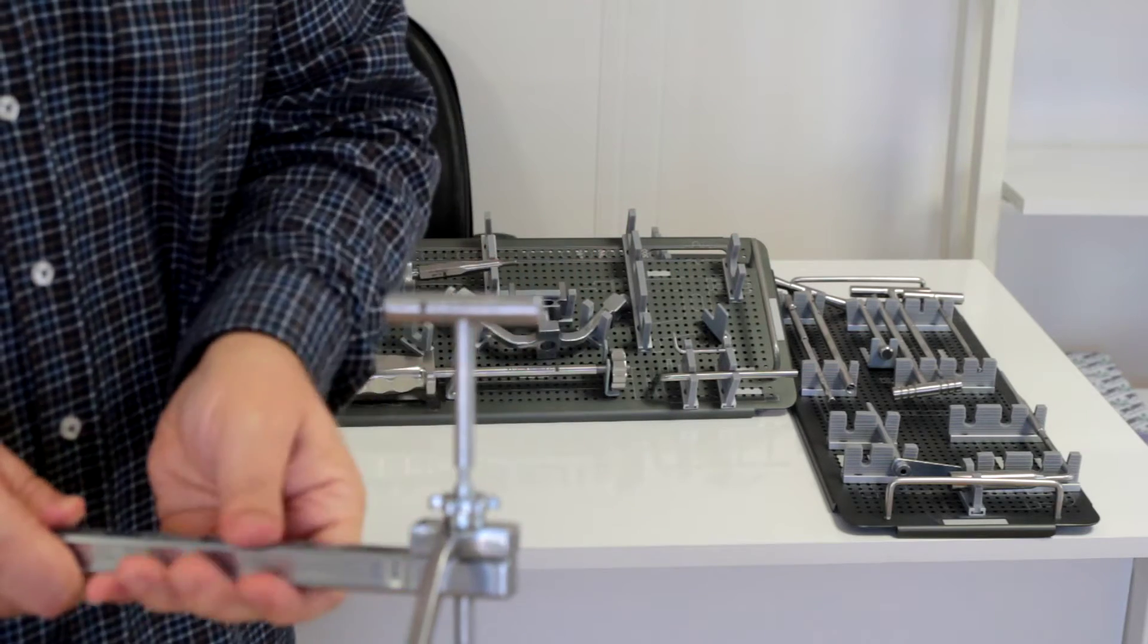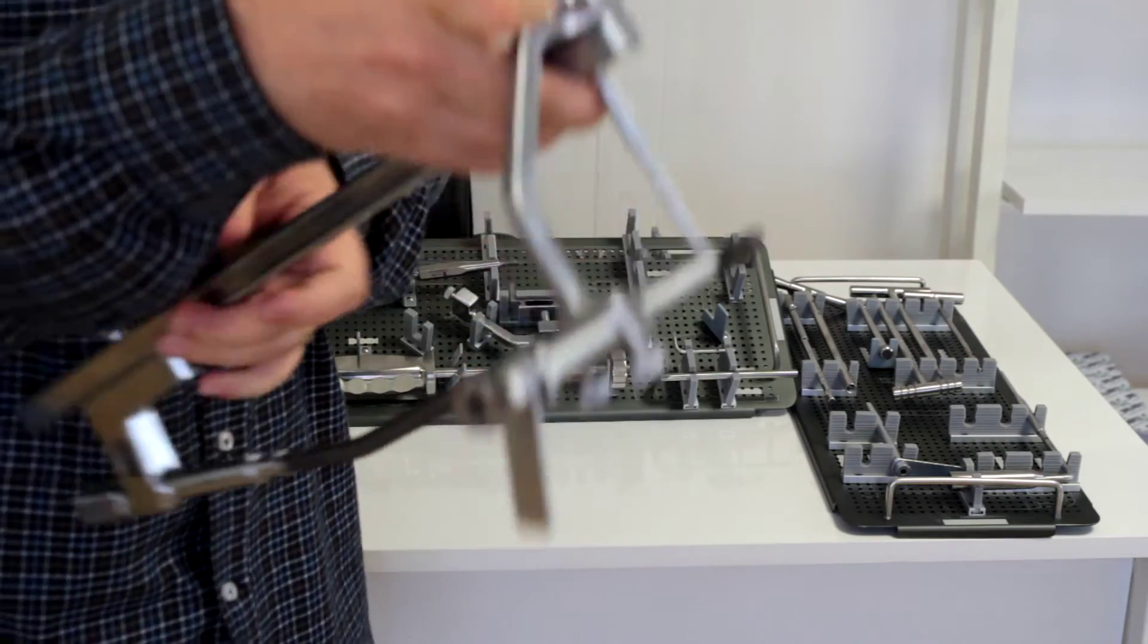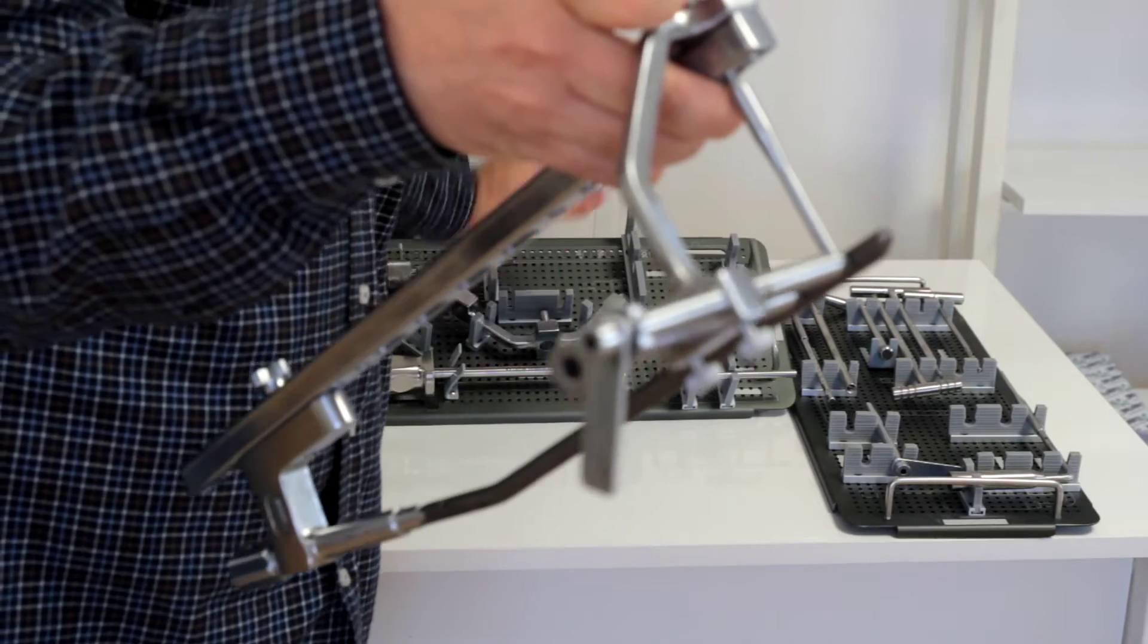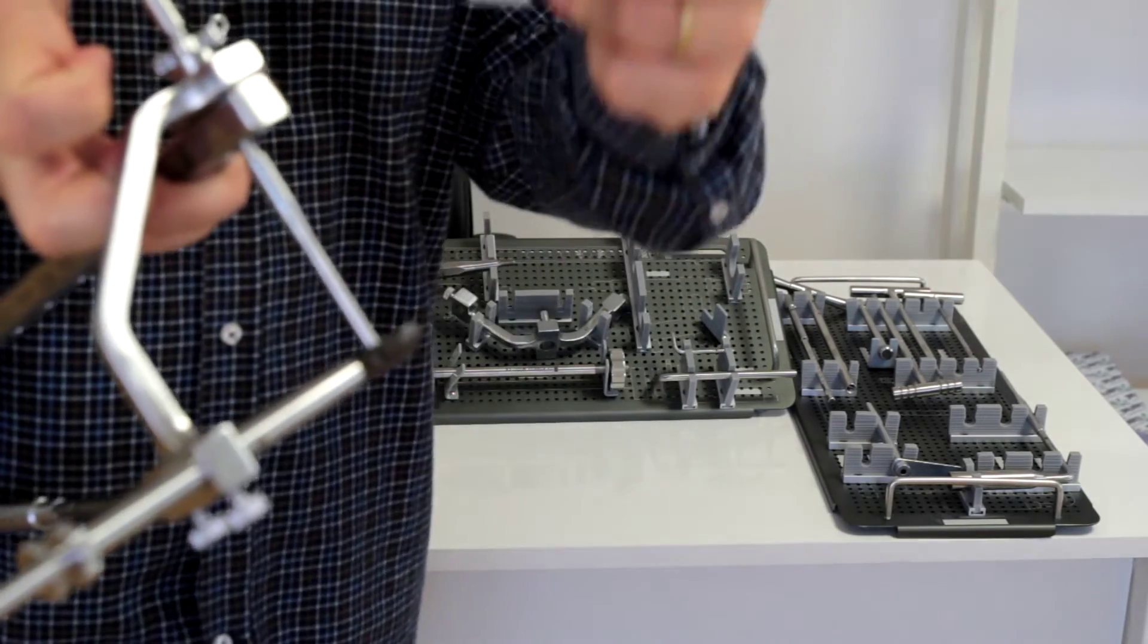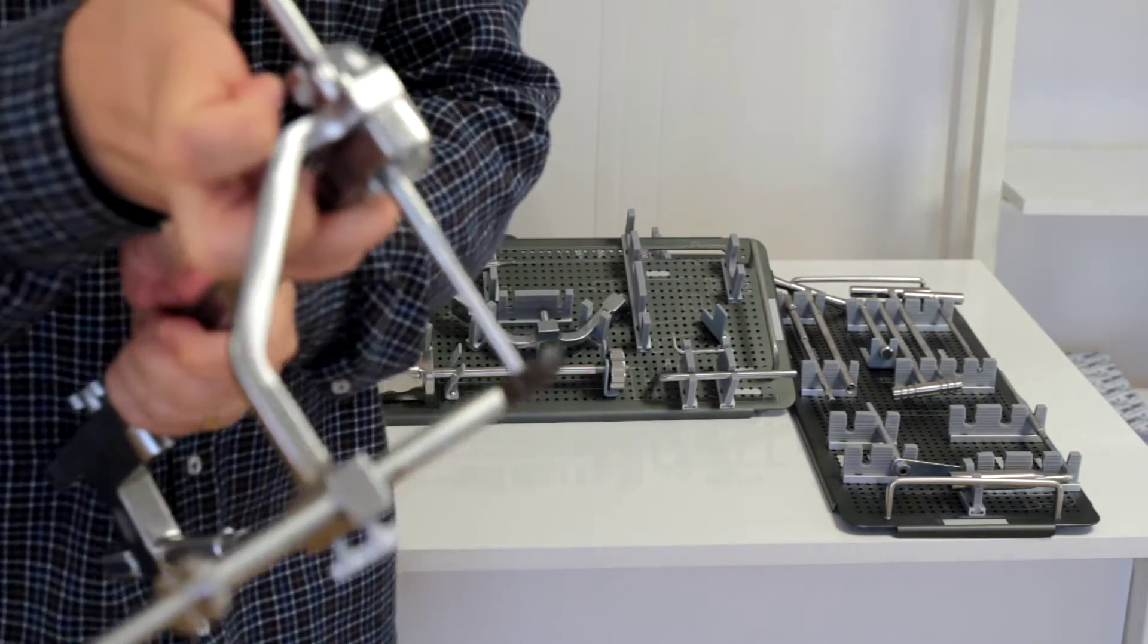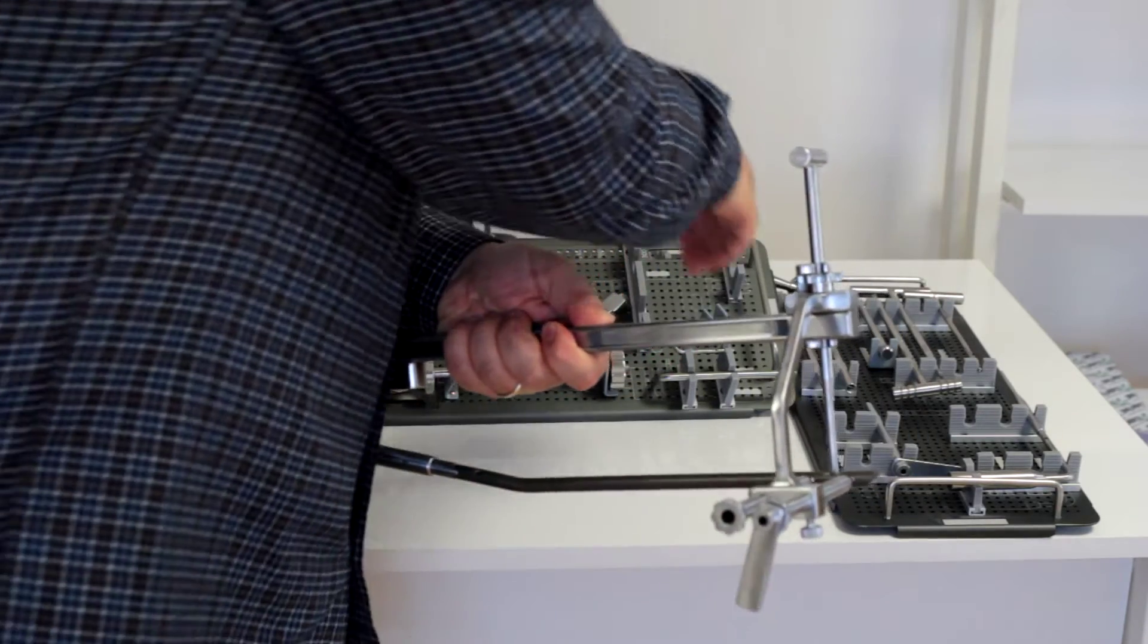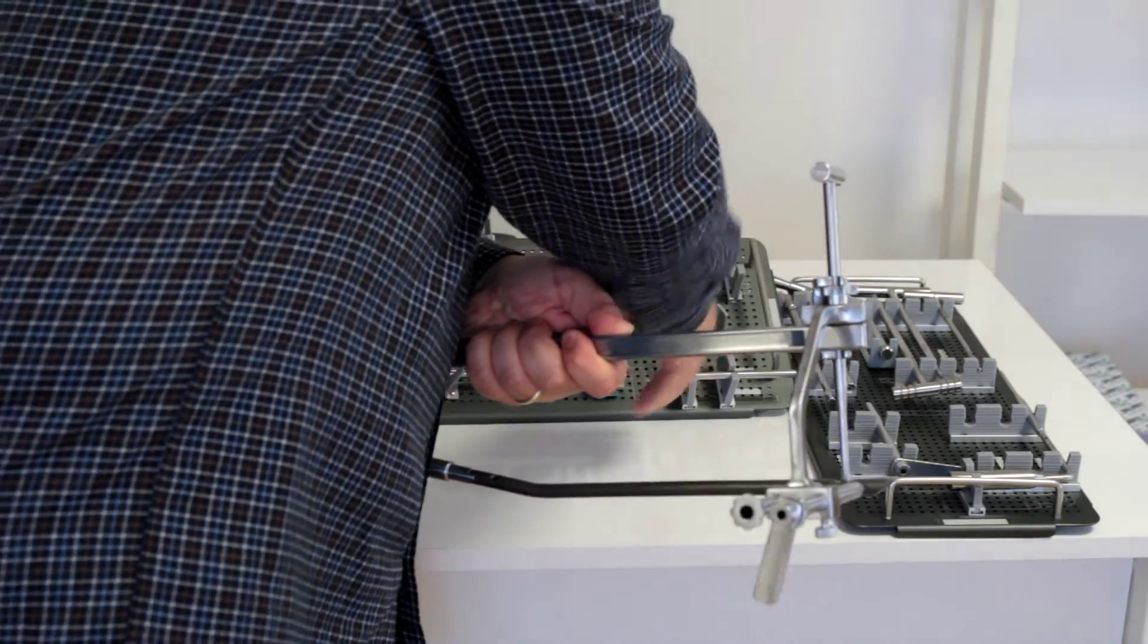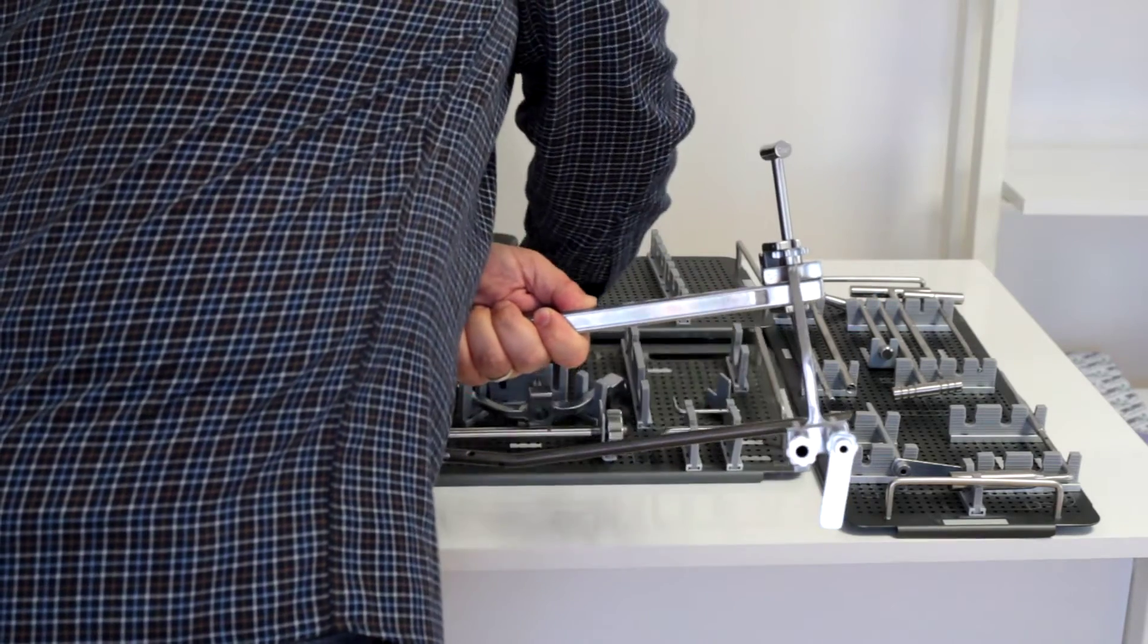Just place the guide, push down, and lock with this U-shaped bar. As you can see here, now the drill can go through.